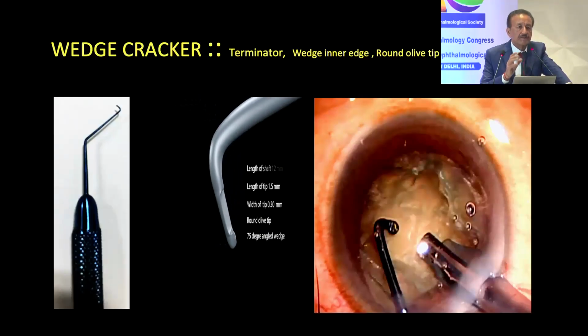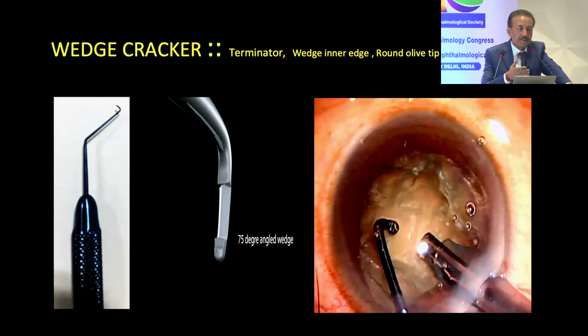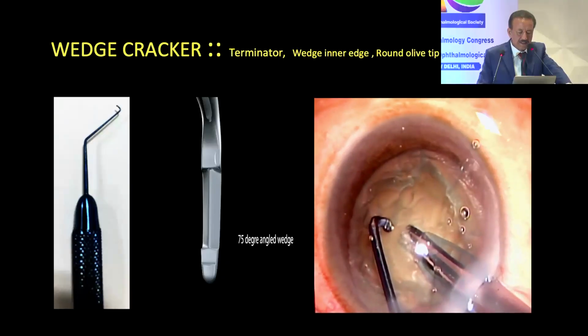It's a round and blunt tip, because when you are hooking the nucleus, even if you hit the posterior capsule, it's not going to threaten the posterior capsule in any way. And then it has a wedge shape. There is an internal wedge, as you can see here, like a chisel, not like a normal cracker, which is flat and sharp. It's a wedged cracker.